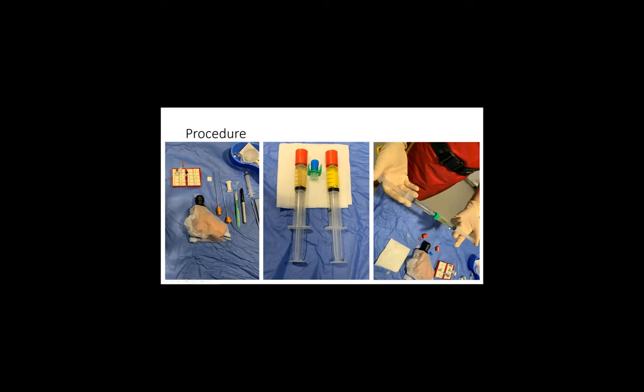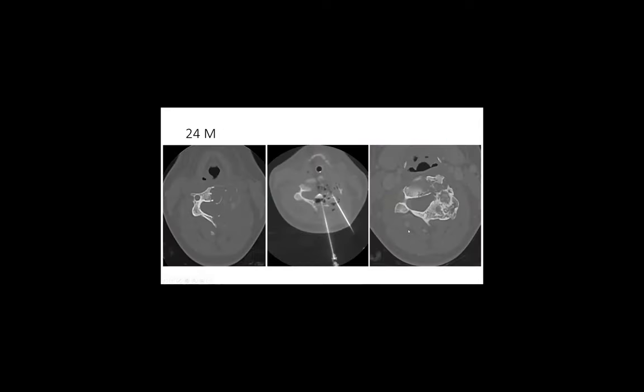This is me mixing the albumin and doxycycline and going back and forth, creating that foam. At the end, it turns into this white foamy substance, and then we inject under CT guidance into that cavity. Here's an example how this could work.